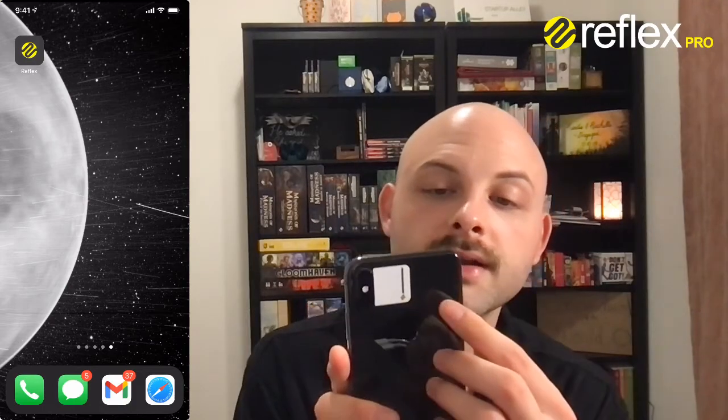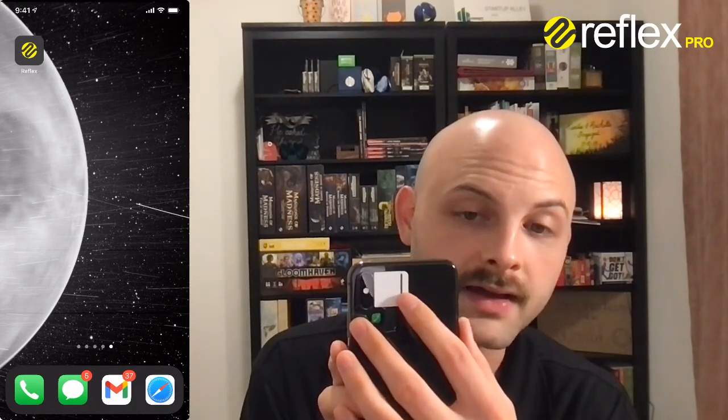This is what you'll have the patient focus on. This is calibrated between the camera that you will be lining up with the patient's eye, and then the center of the face where they'll be tracking that point as you get closer. And that allows for proper framing of the Reflex application so we can get the measurement. So that is everything for near point of convergence testing.